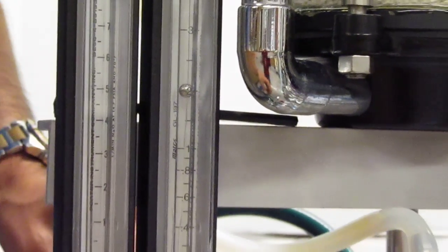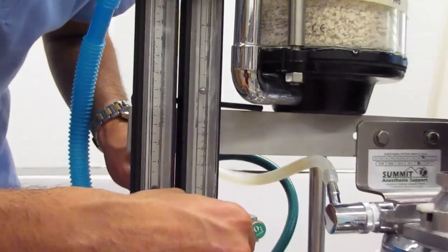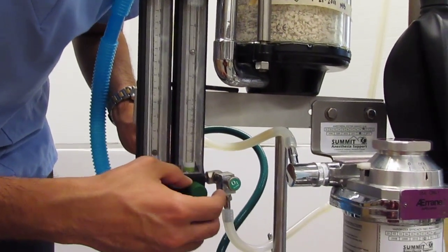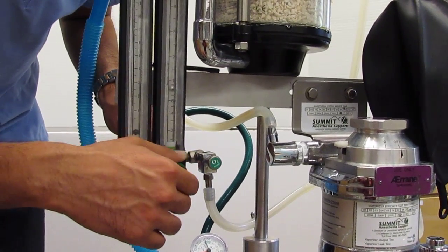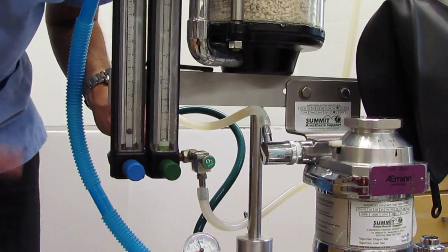One thing about using this dial on the flow meter is that you don't have to crank it. You can open it gently and you get a change in the reading. You can also close it and as soon as I hit zero, that's it, I'm at zero.